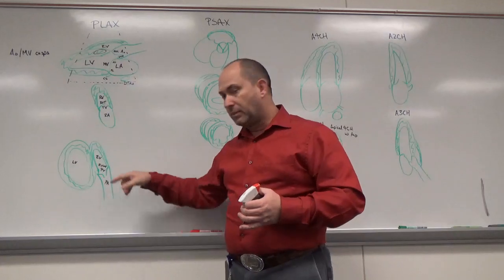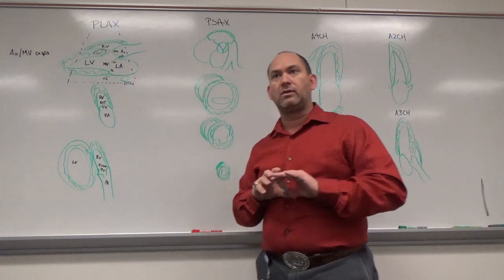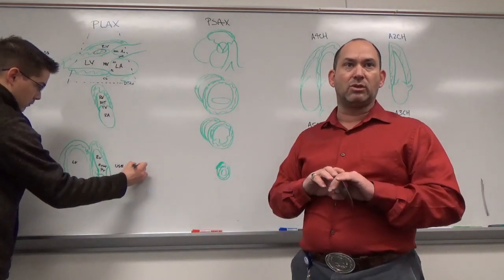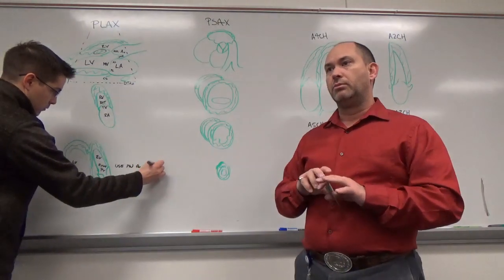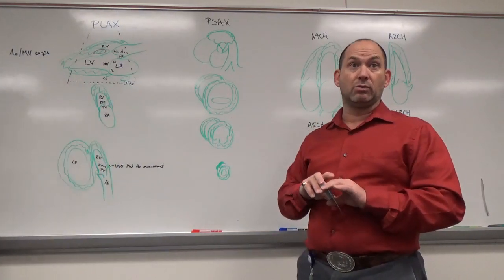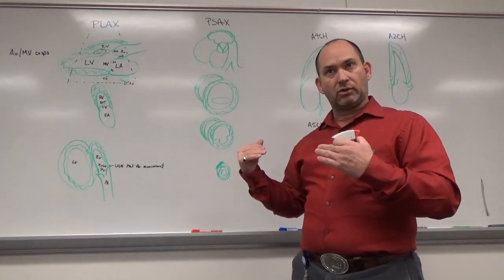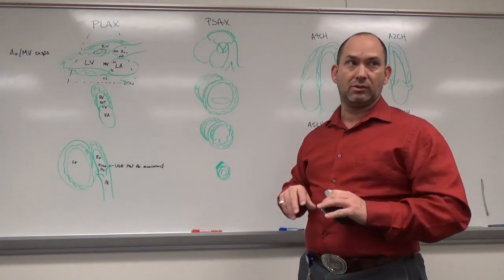Okay. Again, I'll reiterate, the resource under the modules in Canvas has all these documents. Go through those documents because it's going to help you understand where to measure things and what the timing of the measurements are. There's a set of PowerPoints that I created that shows you how to measure both Doppler waveforms and the walls and everything else. We'll go over some of it today, but that's your resource to go back to. Keep note that if you go through it on Canvas, you're just going to see the pictures of the slides. There's notes on those slides as well, so you might want to download it and see the notes section, because it tells you all the intricacies about those.